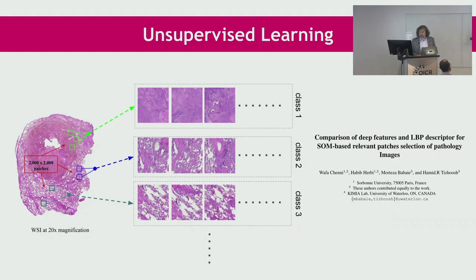One of the problems is you have to deal with unsupervised learning. If we cannot bug the pathologist all the time, saying please give us this, please give us that, then the value of unsupervised learning will be emphasized. So you have to work without labels. You have to work without targets, which parts of the AI community will assure you is the actual AI. The actual AI does not even need the target. The actual AI will go in and figure it out on its own.